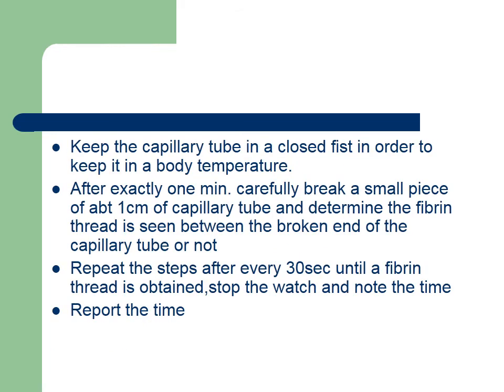Keep the capillary tube in a closed fist to maintain body temperature. Exactly after one minute, break a small piece of about 1 centimeter and check whether a fibrin thread is seen between the broken ends. Repeat this step every 30 seconds until you see a fibrin thread. When the fibrin thread appears, stop the stopwatch, note the time, and report it.